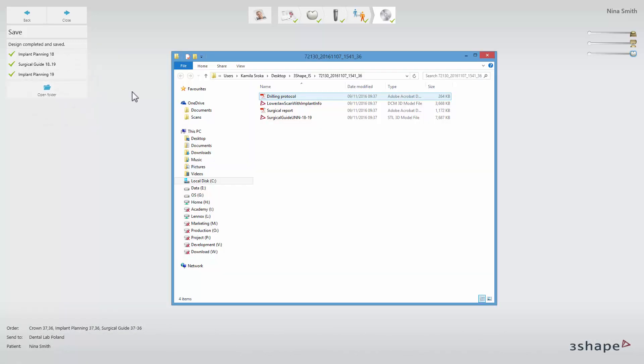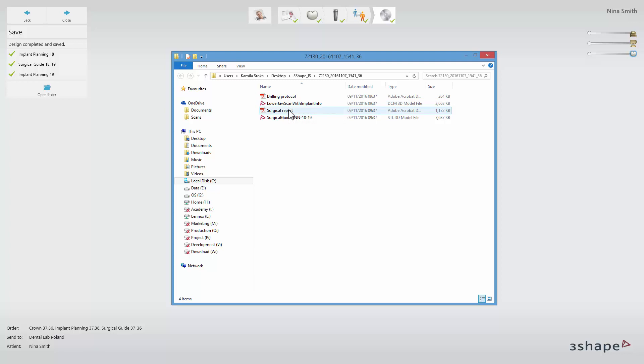The output files include a PDF drilling protocol, a DCM file with implant information, a PDF surgical report and an STL surgical guide file.